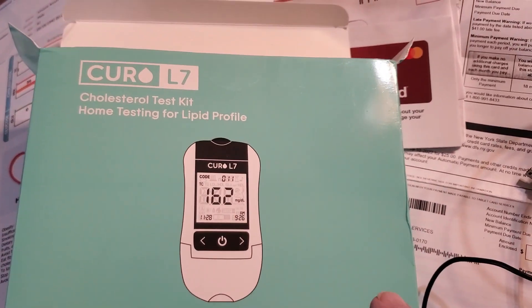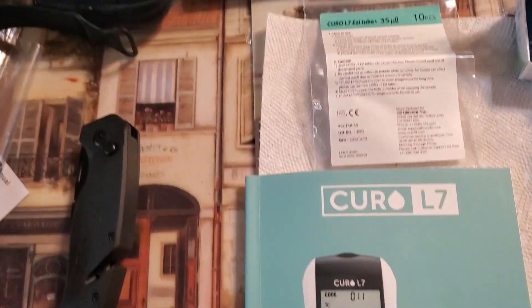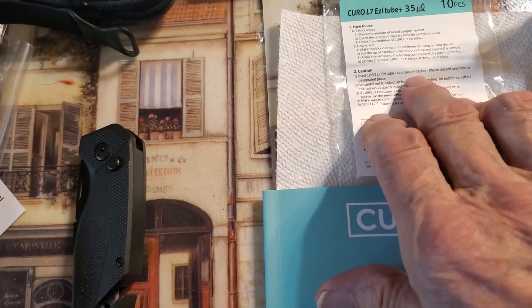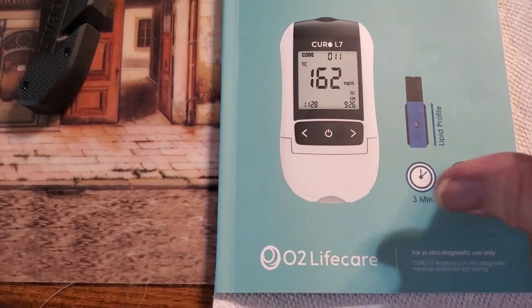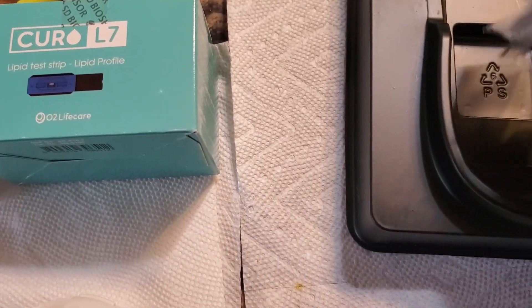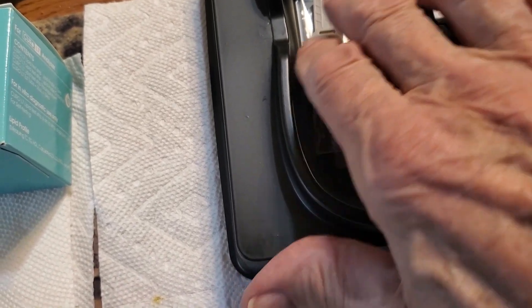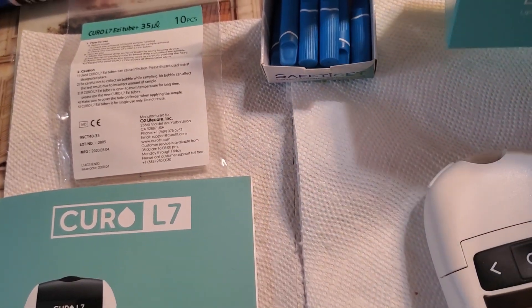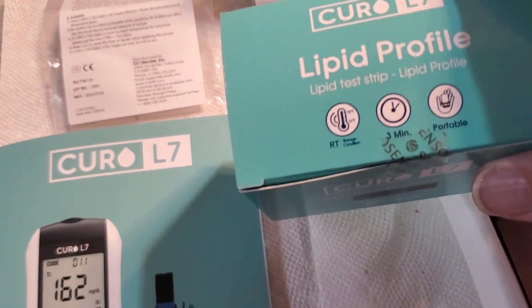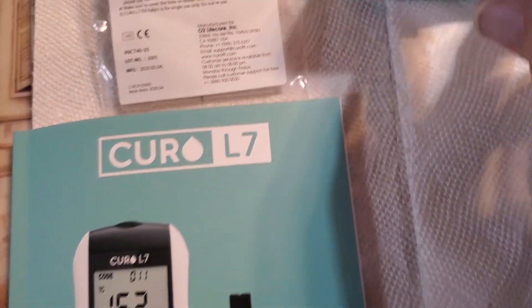Here is the Curo L7 Cholesterol Test Kit and what comes in it. You've got the capillary tubes — they call them easy tubes. Here's the book, it comes with a test strip. It comes with 10 of the lipid profile strips and then it comes with 10 finger stickers.